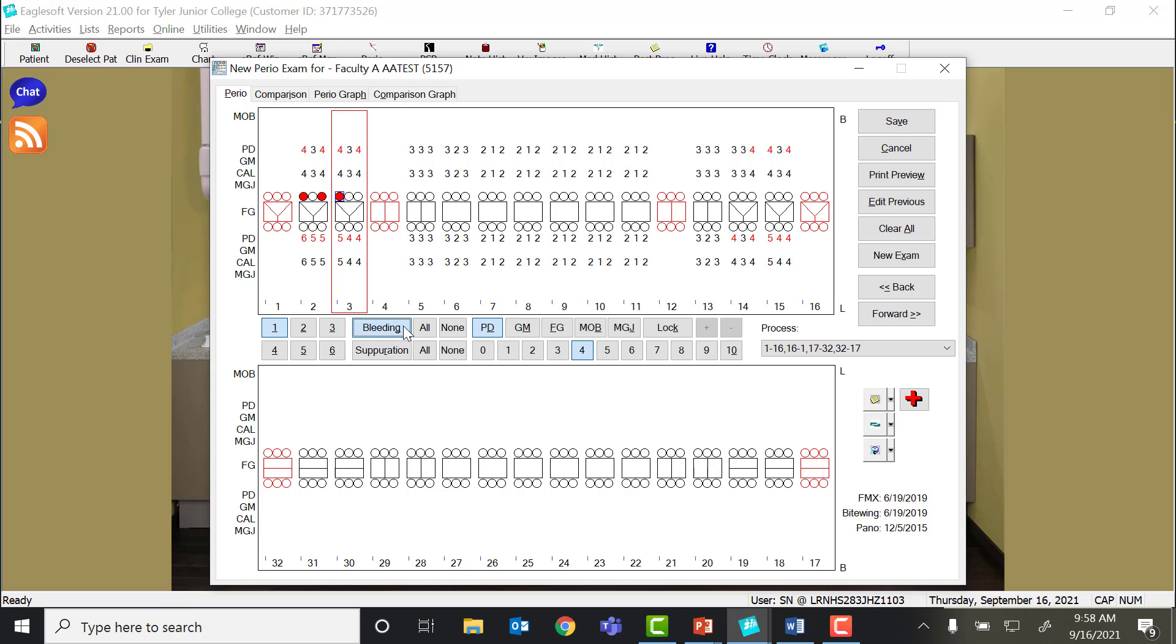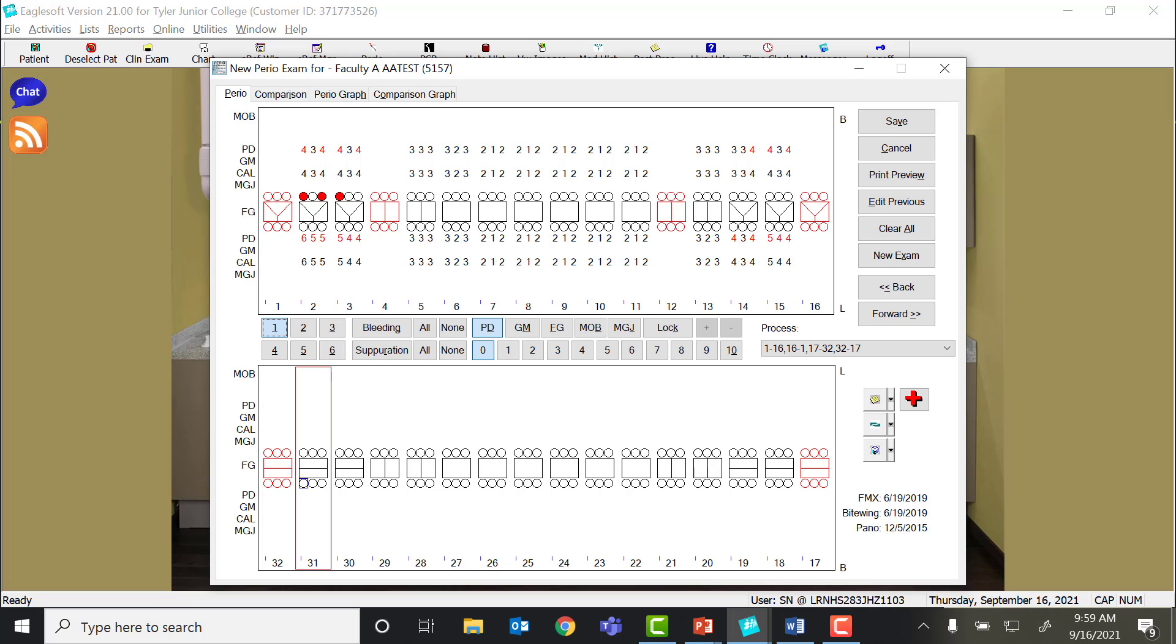If you look at the word bleeding, the letter G is underlined. And so the shortcut for bleeding would be G and then the number. So if I do G7, it will automatically do the bleeding point in that tooth.